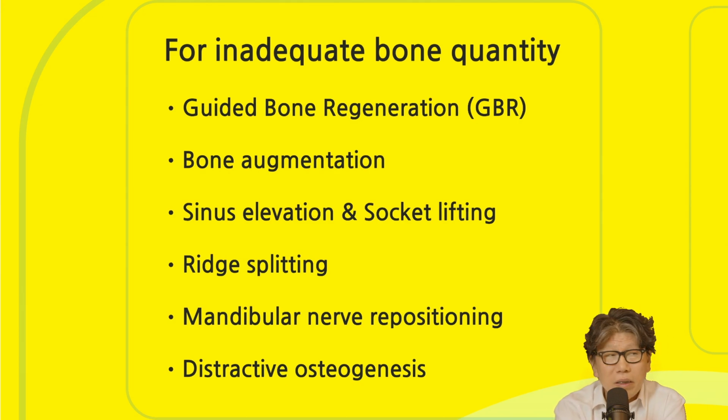And then there's now sinus elevation, so there's a lateral approach to put the graft in. And then there's a crestal approach under the sinus, which is called a socket lift. I do this a lot. I also do sinus elevation. And I think in cases where the socket lift fails, where you need this extensive maxillary sinus bone graft, I think sinus elevation is advantageous. But I still do a lot of socket lifts.